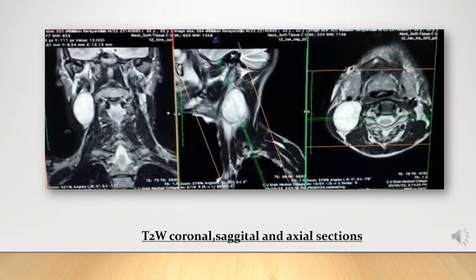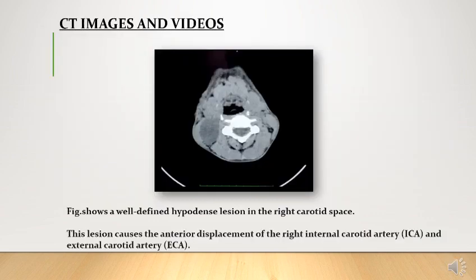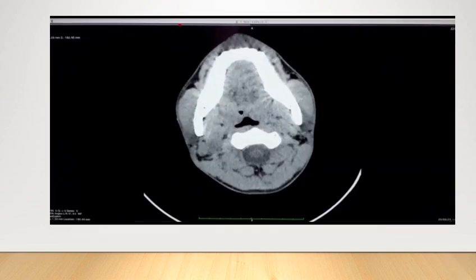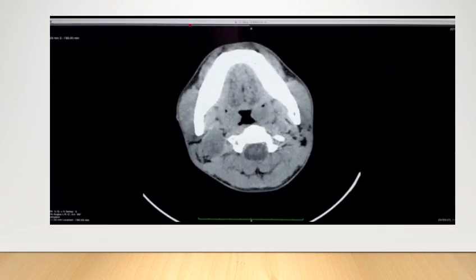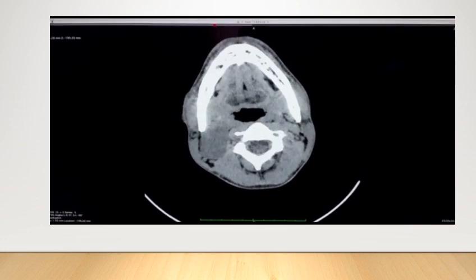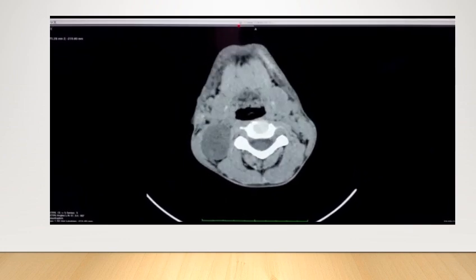The video shows the soft tissue window of CT neck showing a well-defined hypodense lesion located in the right carotid space, causing anterior displacement of the right internal carotid artery and the right external carotid artery. Axial CT scan brain window also shows a well-defined hypodense lesion located in the right carotid space.